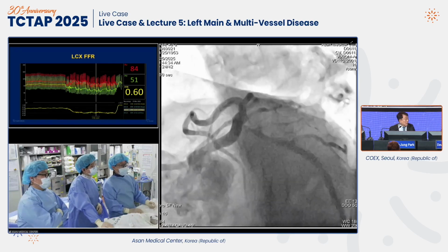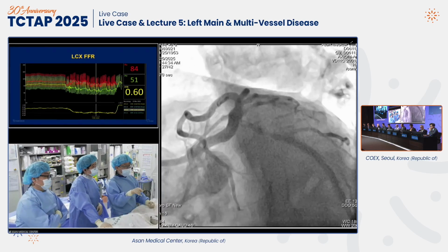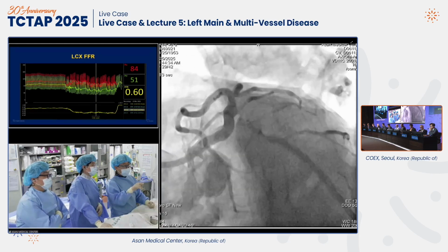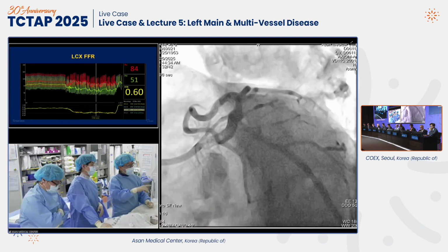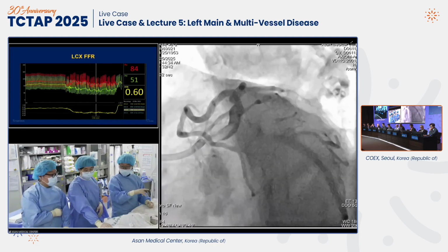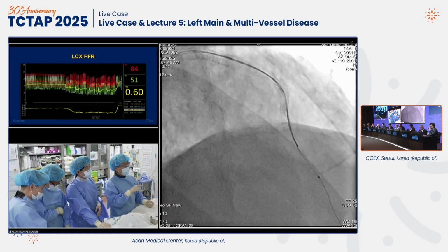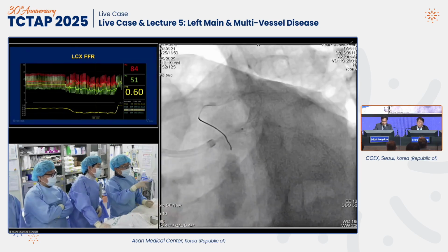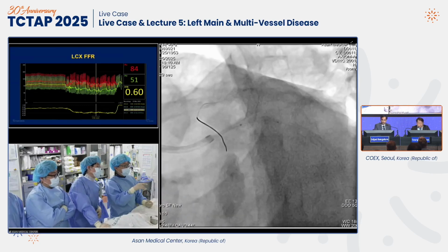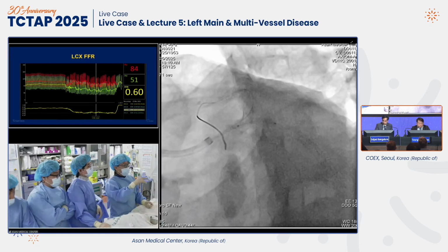We are trying to evaluate the anatomic lumen, the inner side of the lumen, and we try to go through with the IVUS catheter into the circumflex, not through the circumflex ostium. So we did a 2.5 compliant balloon. Can you show us the angiogram at the time of the compliant balloon? After implantation of the compliant balloon, we evaluated the LAD part and the circumflex part, and the wire passed easily. There was a 2.5 compliant balloon, and then we evaluated the whole segment of the circumflex ostium as well as the LAD.